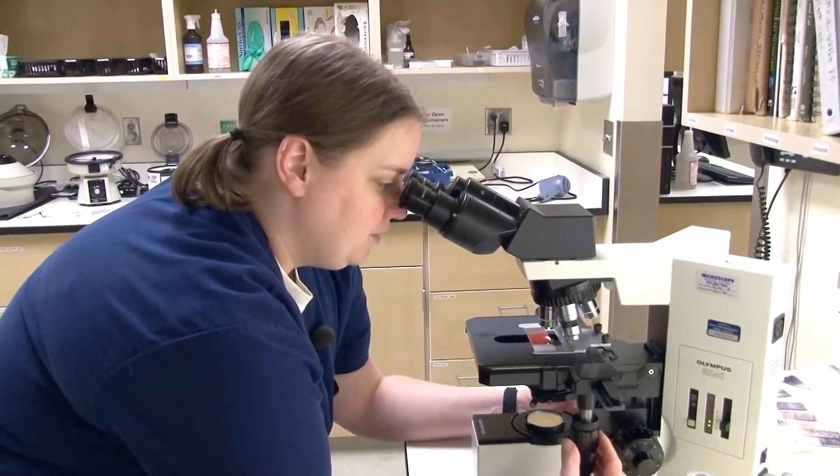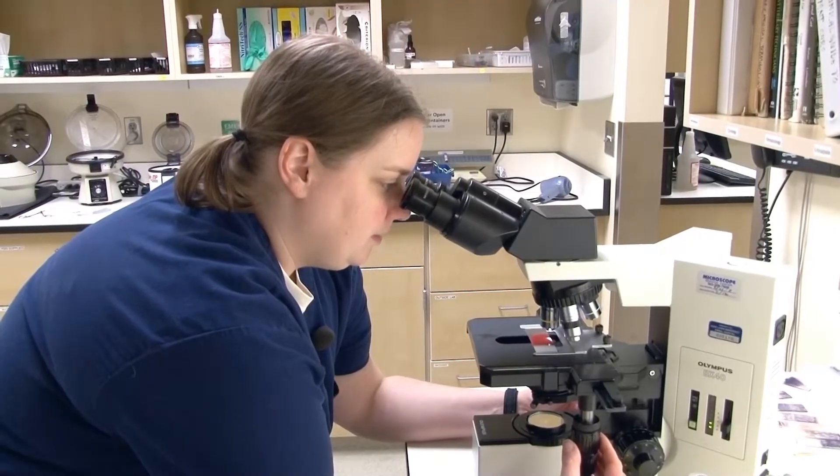Looking through the rest of the slide, I don't see any Rouleau. If I did see both, I'd put a little bit more saline on and check again. But that's how you do a saline agglutination test.